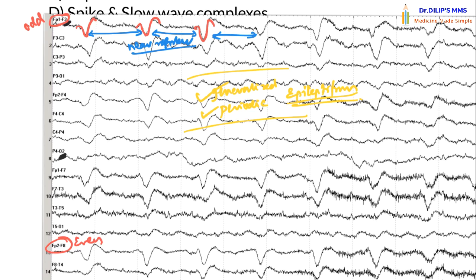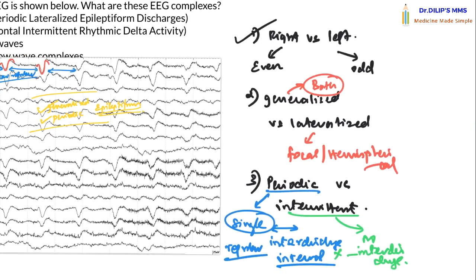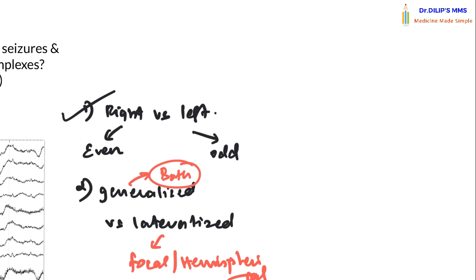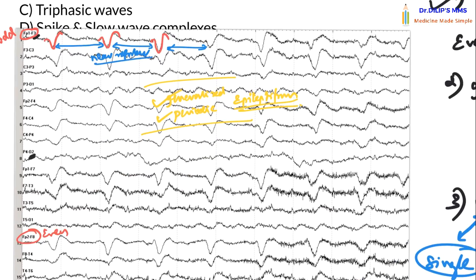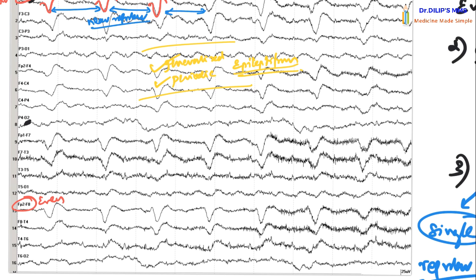One important type of generalized periodic epileptiform discharge is triphasic waves. Triphasic waves show a characteristic initial negative deflection (upward in EEG), followed by a positive deflection (downward), and then another negative deflection (upward again). There are three characteristic deflections — negative, positive, then negative — which is why we call them triphasic waves.